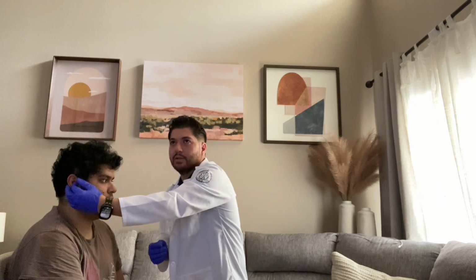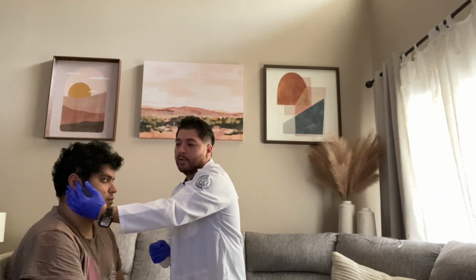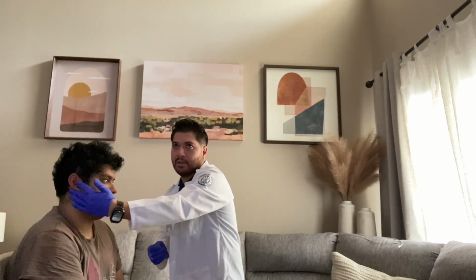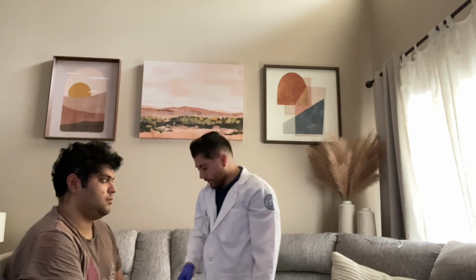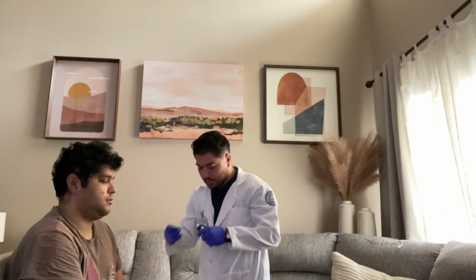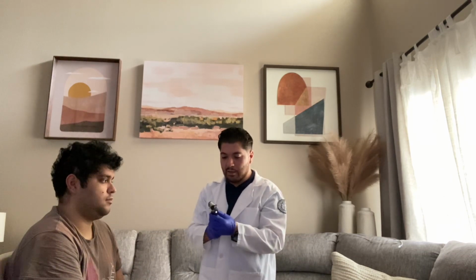We can also palpate the auricle, the tragus, and the mastoid areas, making sure the patient doesn't have any tenderness in those areas. And now we look a little bit deeper with the otoscope. And with this, we look at the ear canal.